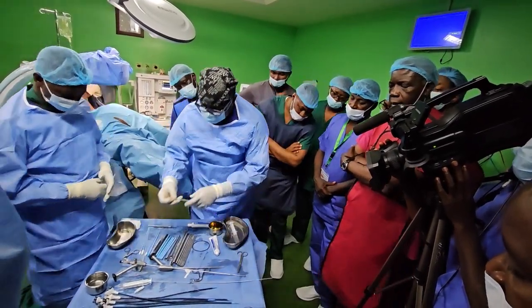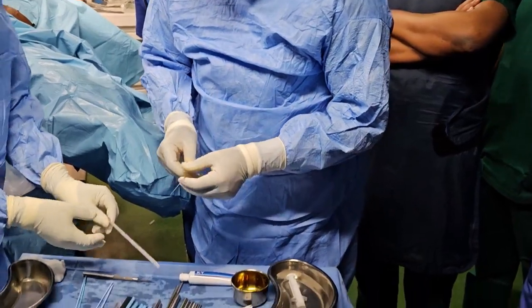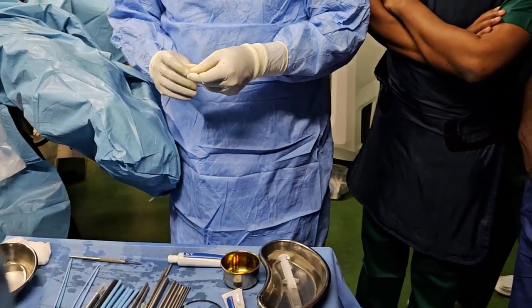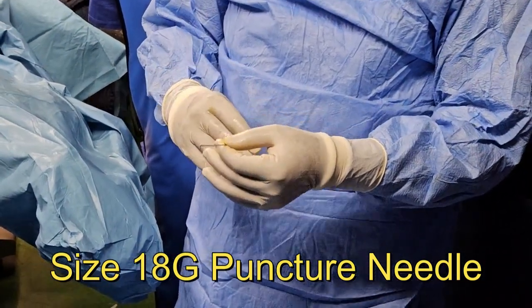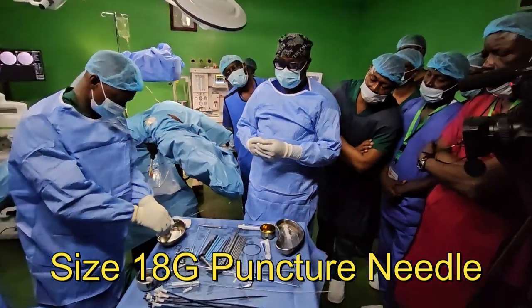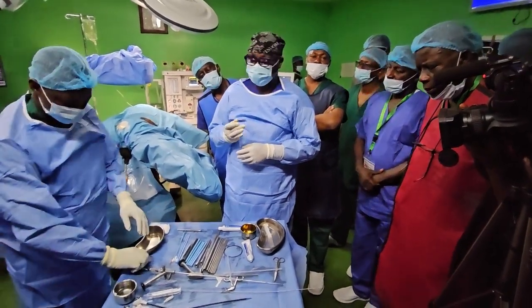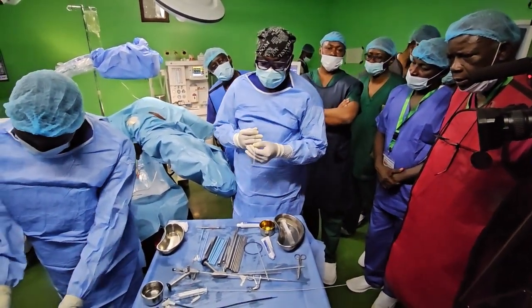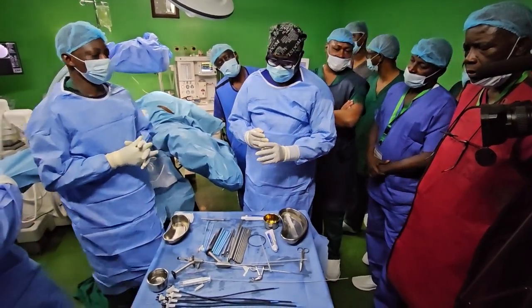This is the puncture needle. Okay? This is a 2-part puncture needle. There are 3-part ones and all of that, but I use 2 parts. And this is size 22, I think. Okay? So the idea is the puncture. This is Cook. It's one of the best, arguably the best in the industry. No conflict of interest. I don't market for them and I don't represent them for anything. But in my experience, it goes in smoothly. The puncture is good. So it's a 2-part needle.